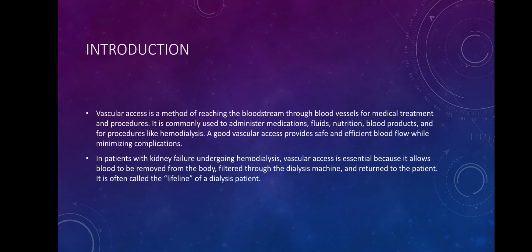Vascular access is a method of reaching the bloodstream through blood vessels for medical treatment and procedures. It is commonly used to administer medication, fluid, nutrition, blood products and for procedures like hemodialysis. A good vascular access provides safe and efficient blood flow while minimizing complications.